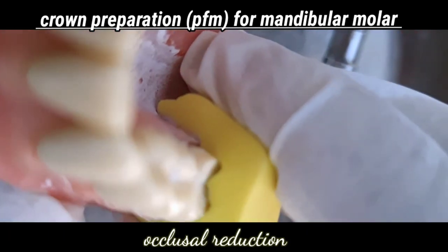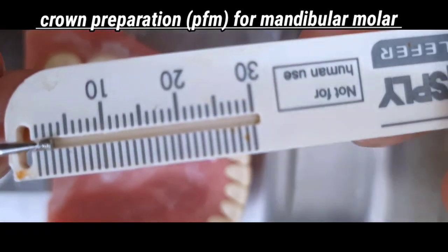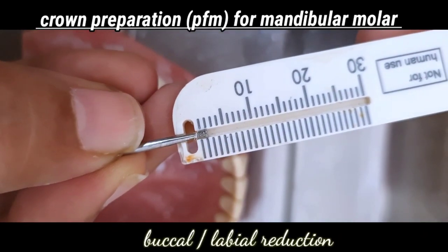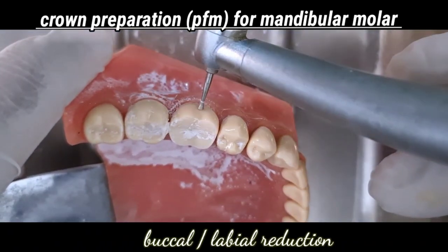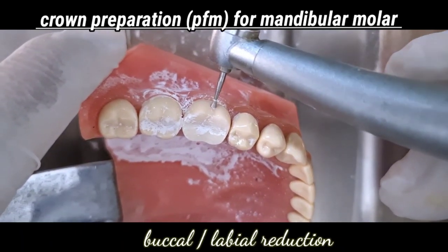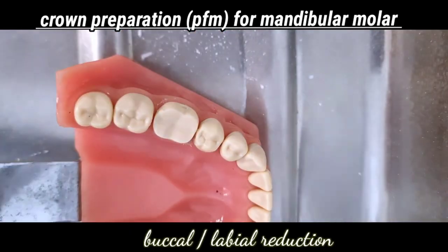So this is the reduction we see in the putty index. Now we are proceeding with our tooth preparation with the labial reduction, and the first step in the labial reduction is making the depth cuts or the depth orientation grooves. We are using an inverted cone burr for making depth cuts. You can also use a round burr or flattened tapered burr to make the depth cuts.